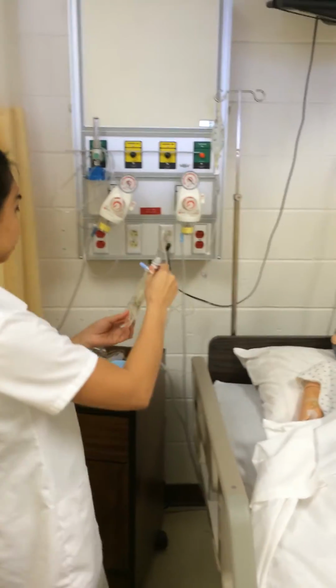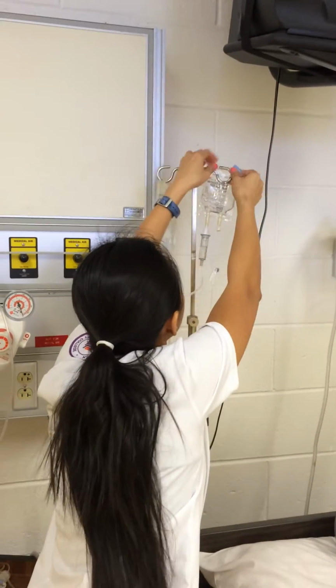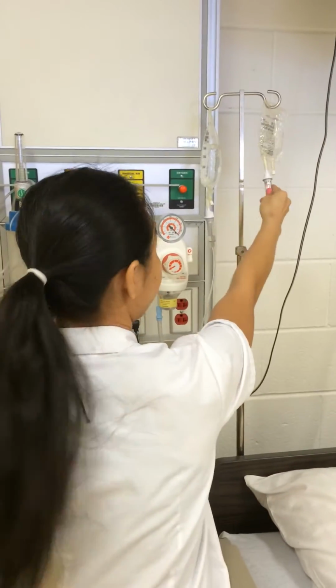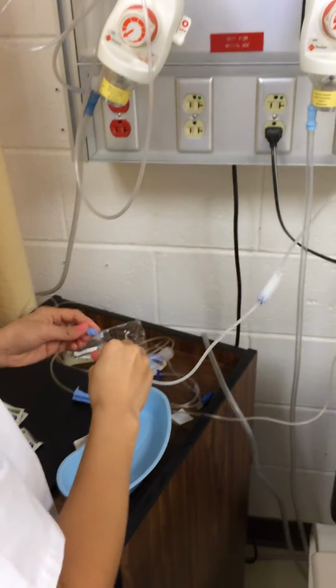I am going to hang it. I fill the chamber halfway and I prime the tube. So make sure there's no air.